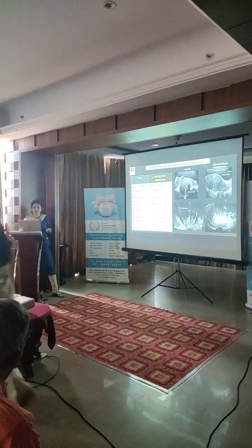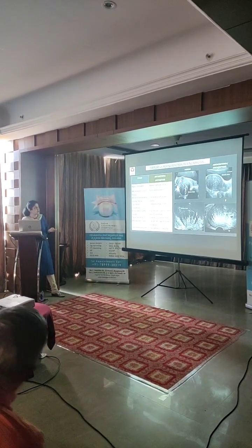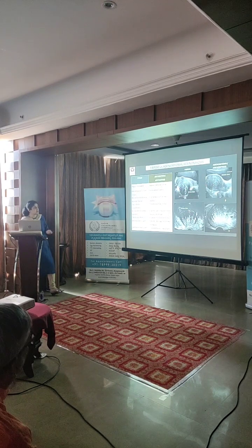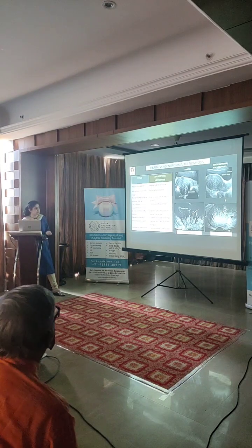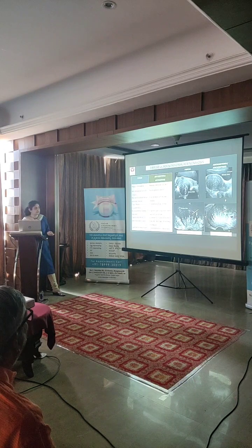So what helps us distinguish? The first thing is the uterine body may be regular or lobulated with fibroids, whereas in adenomyosis, if it's enlarged also, it is typically a globular shaped uterus. Secondly, fibroids have well-defined margins, as you can see here, in contrast to adenomyosis, where the margins are poorly defined. You see internal linear shadowing in both these lesions, but what is very typical of fibroids is the presence of these edge shadows because they are well-delineated masses.